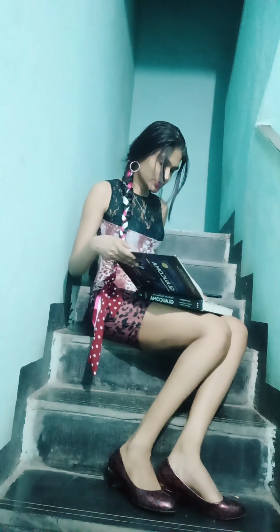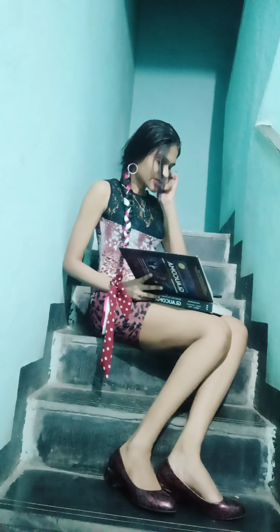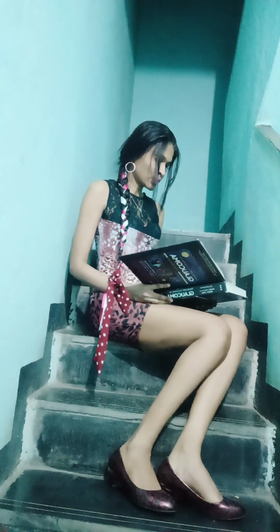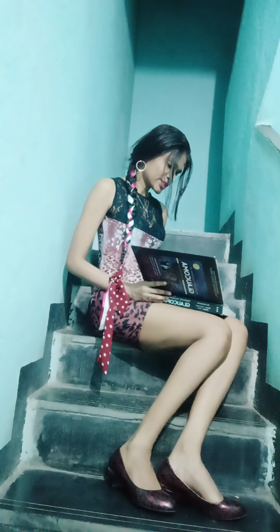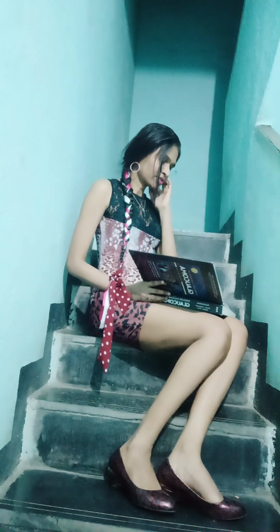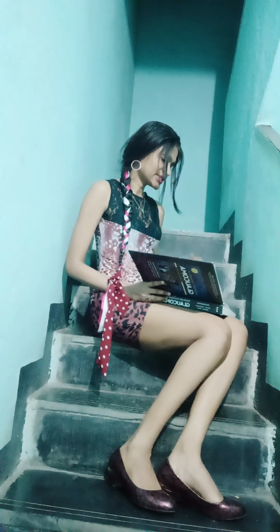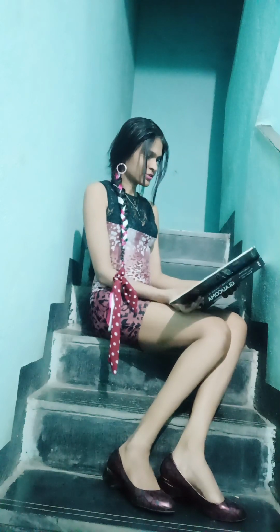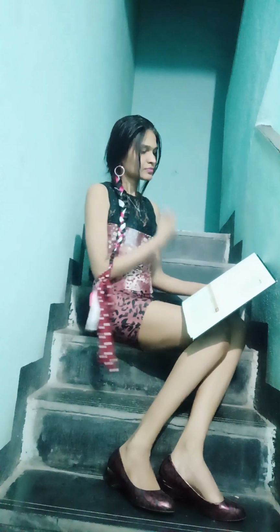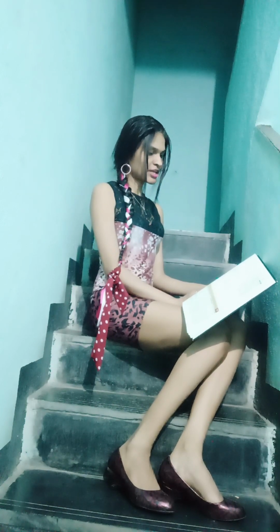Now, in indirect gonioscopy, the gonio prism and slit lamp are the only instruments needed. Several types of gonio lenses are available with a single mirror or multiple mirrors. The Goldmann single mirror lens is tilted 62 degrees from the planar front surface, which allows examination of the anterior chamber angle.